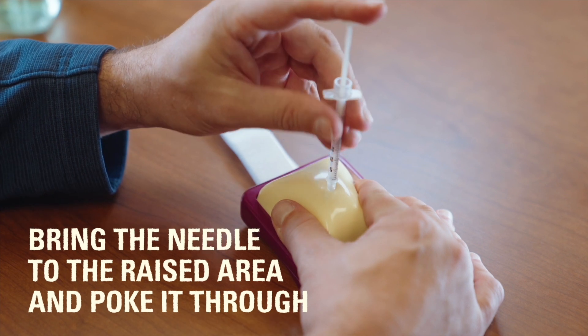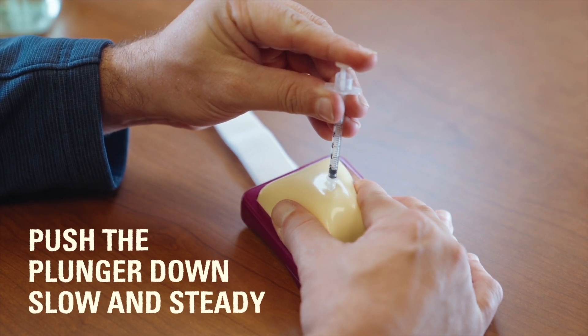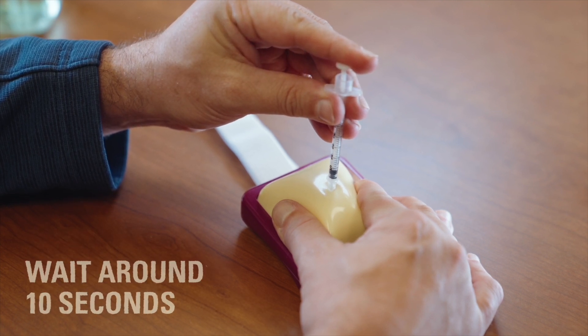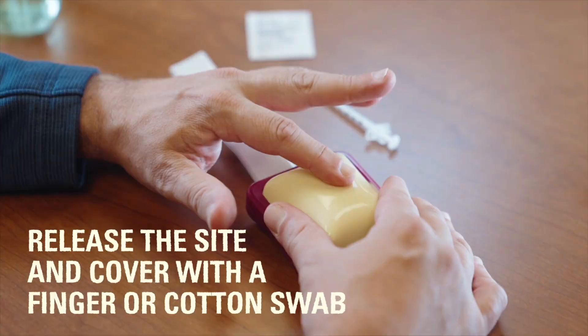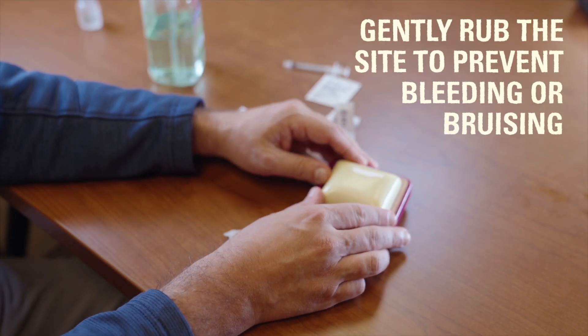Bring the needle to the raised area and poke it through the skin. Push the plunger of the syringe slow and steady. Wait around 10 seconds to let the insulin spread under the skin. Let go of the pinched skin and put a clean finger or dry cotton puff over the site as it is pulled out carefully. Gently rub the area to prevent bleeding or bruising.